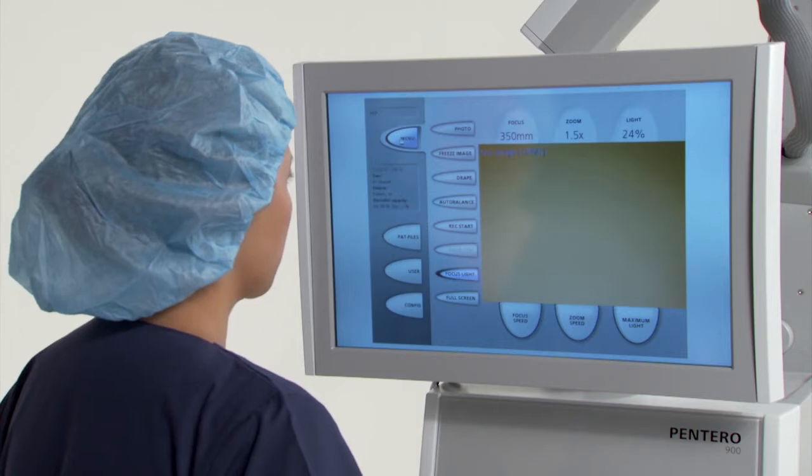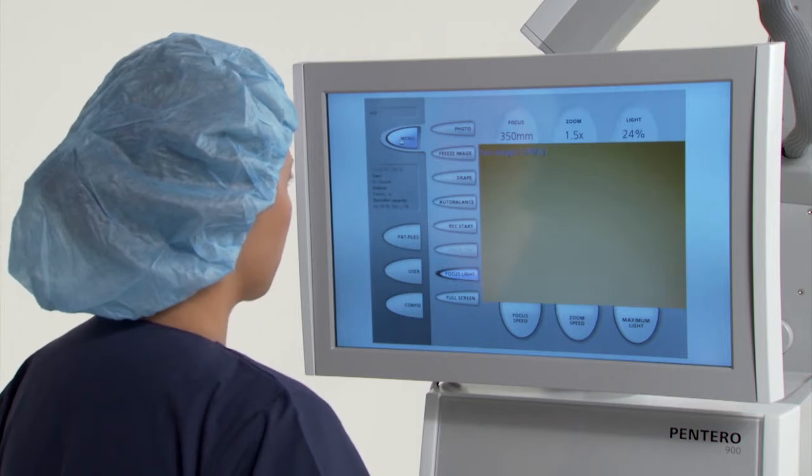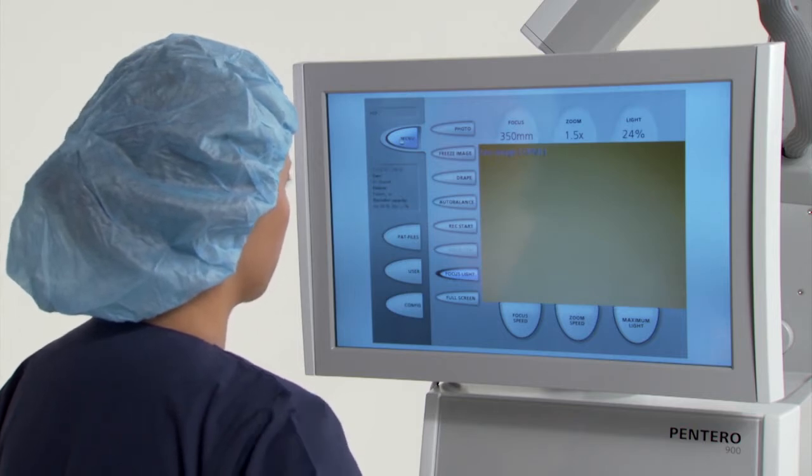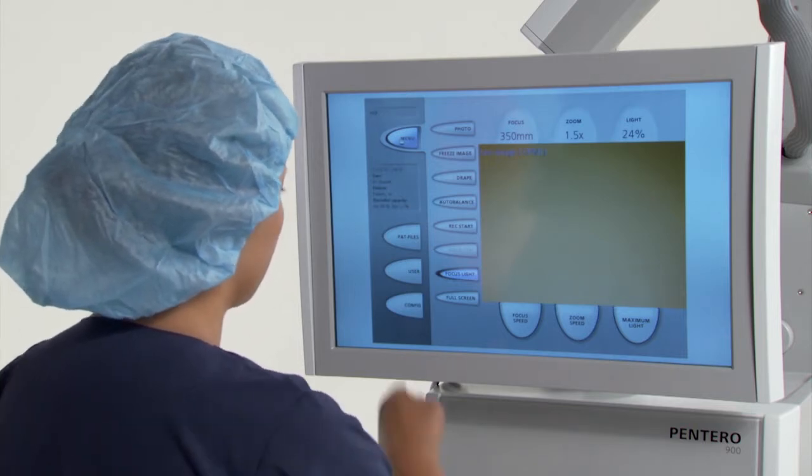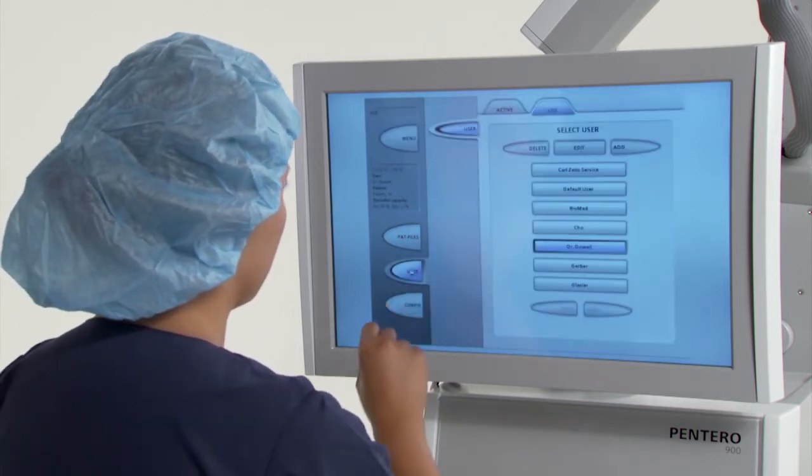To create a user profile, select the user button at the left of the main screen.